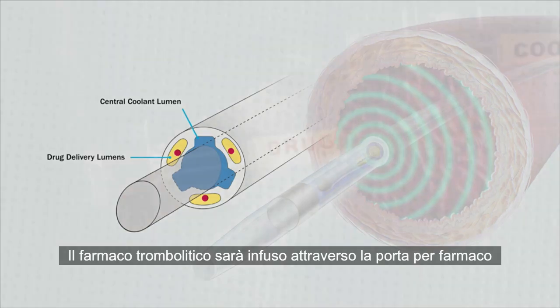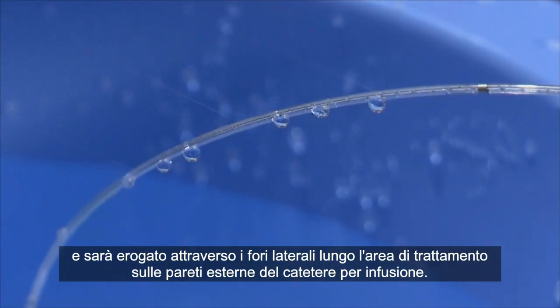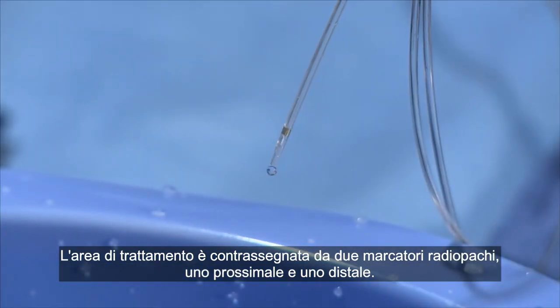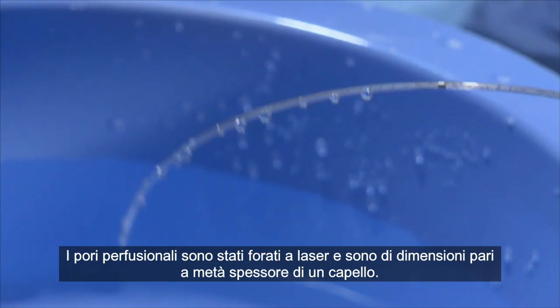The thrombolytic drug will infuse through the port labeled drug and will be delivered out the side holes along the treatment zone on the outer walls of the infusion catheter. The treatment zone is marked by 2 radiopaque markers, 1 proximal and 1 distal. The perfusion ports are laser drilled, about half the size of a human hair.